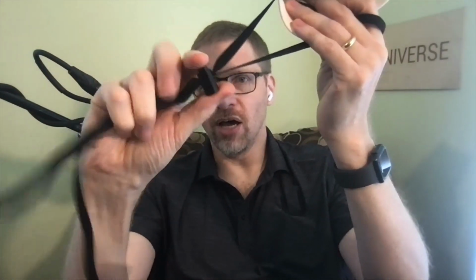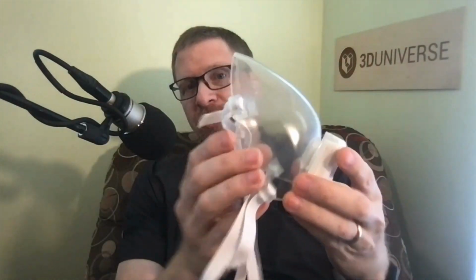So that was mask number one, the BE mask. It's a 3D printable mask, with just a couple of other basic assembly materials needed: some elastic straps, a little barrel lock for adjustability, and that's about all there is to it. We then partnered with a company called Harbeck, who was kind enough to donate the time and funds to create an injection mold for being able to scale up production on one of our mask designs.